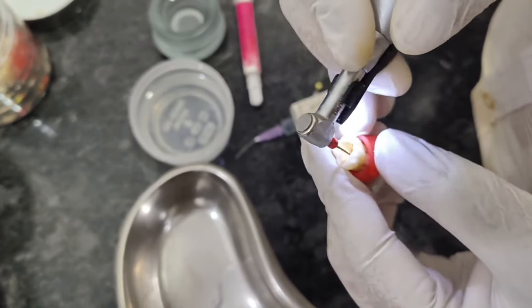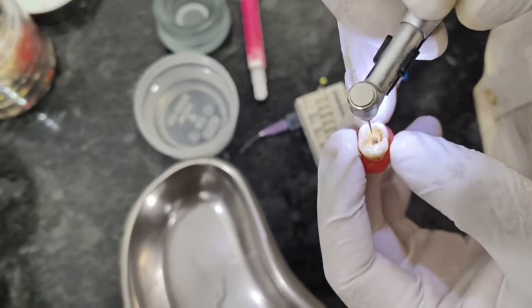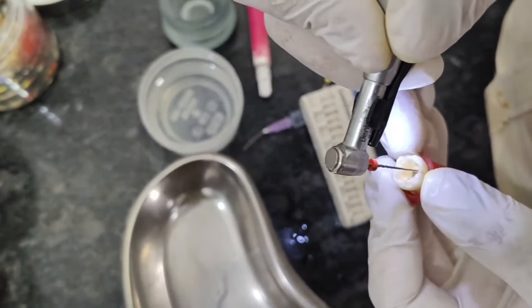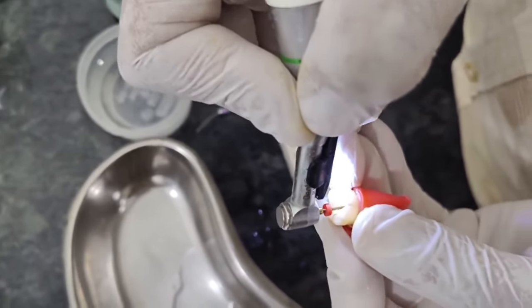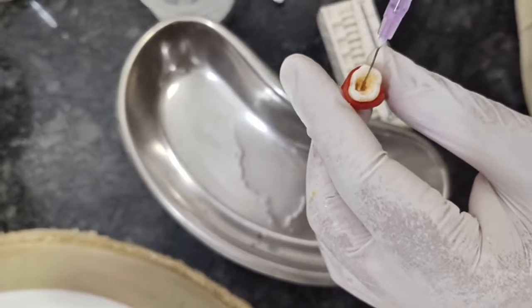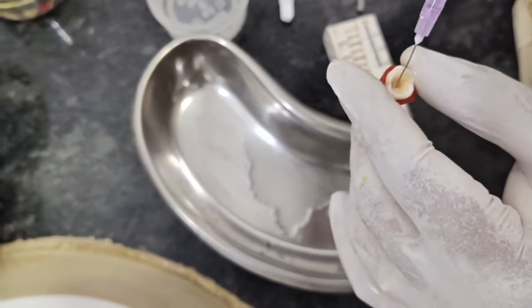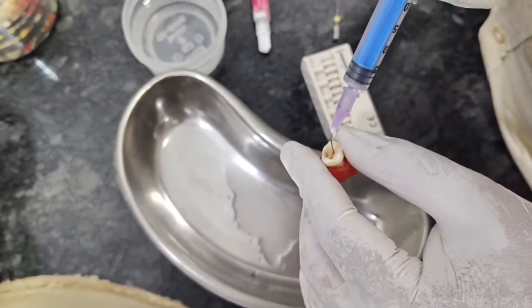So now I'm putting it in the distal canal. Only one time you have to insert and take it out. Then now it's the mesiolingual canal. And now we are putting in the mesiobuccal canal. So this is how you should do the BMP of the tooth in concern, and again I have irrigated. After completing all the filing, you have to put the master cone and check whether your obturation is correct or not. So I have irrigated it.